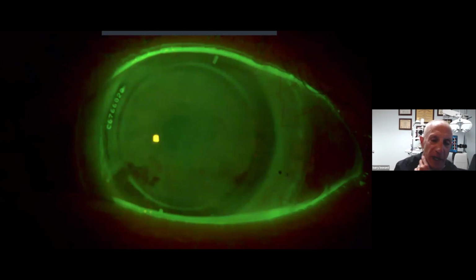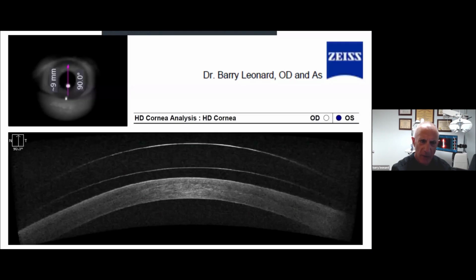And here's the lens. There's a nice picture under the lamp, but with our serial numbers and those hash marks on this lens is the flat meridian. It's just lined up perfectly with what eaglet would predict. And there was that beautiful scan over. That's again the vertical scan. You can see how well centered that is, which I was very surprised at in a high plus lens, but we could really design a lens.